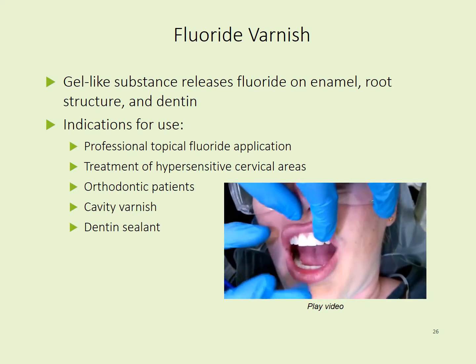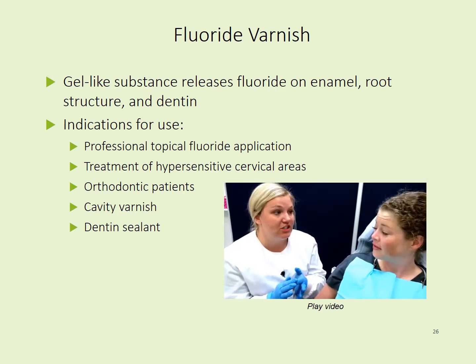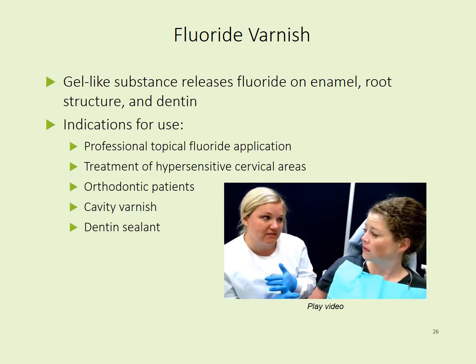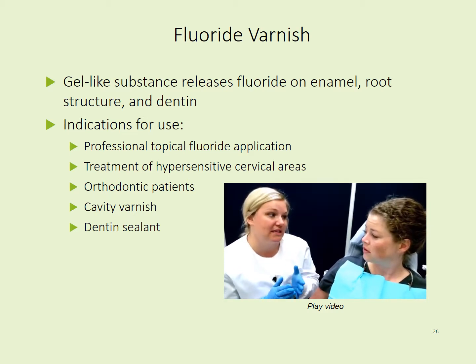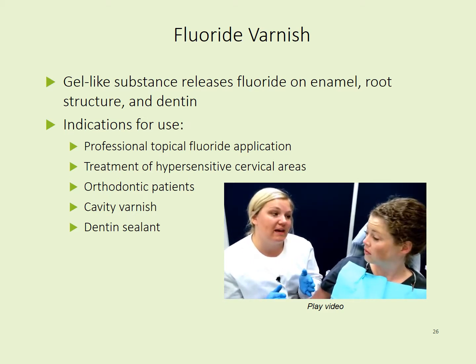Have the patient close slowly, and the patient's saliva will help the varnish harden to the teeth. Also remember to give and document the fluoride post-op instructions to your patient, which are, you can eat and drink right after application. There should be no brushing or flossing for 4 to 6 hours, and also avoid hot, crunchy, or sticky foods for 4 to 6 hours.